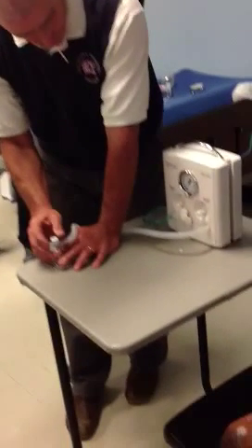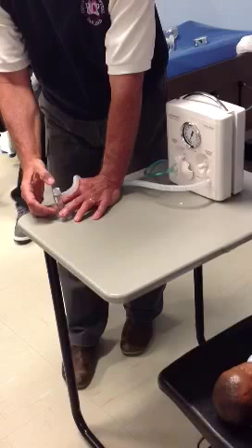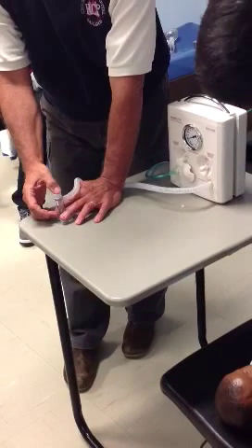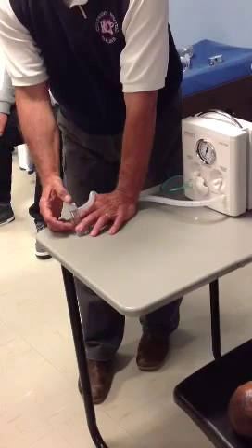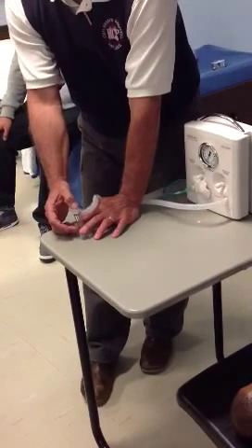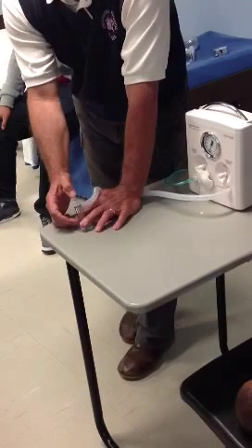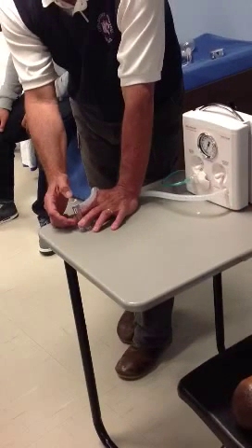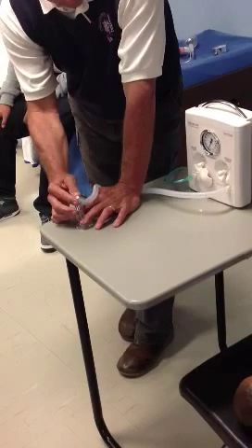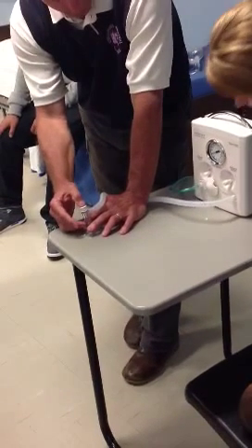Let's go through a scenario real quick. I'm doing 20 over 5. I'm in the delivery room — I've just got this baby, and my saturation is 50. What do I do? Give peep. How do I increase my PEEP? The valve. Thank you. Now I'm giving 20 over 10.